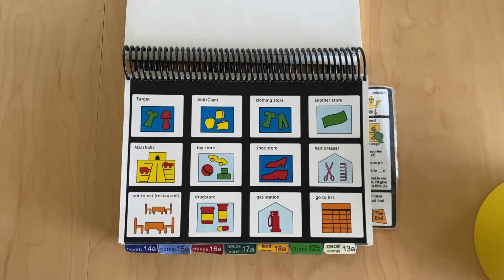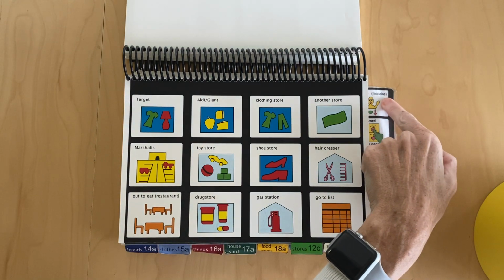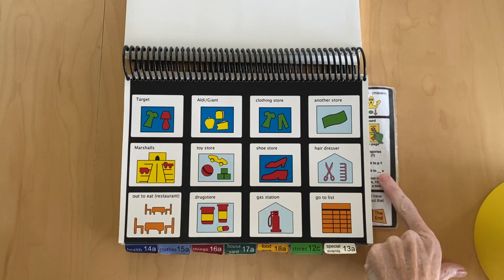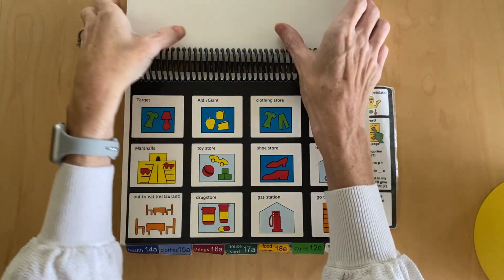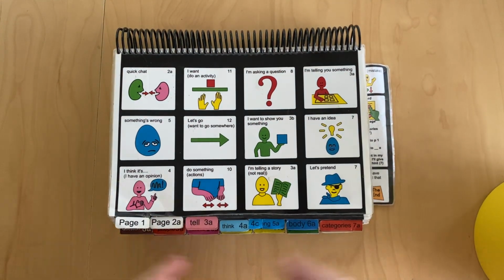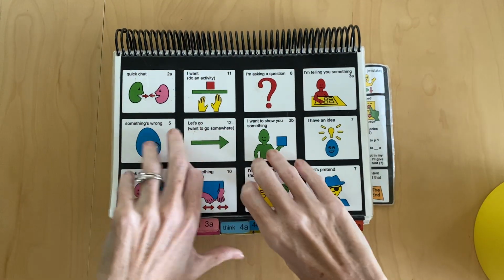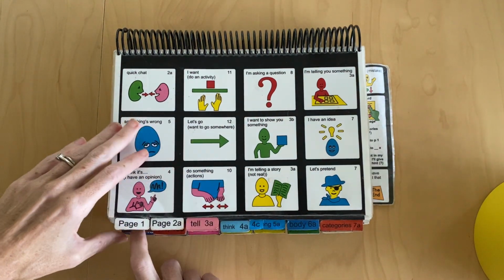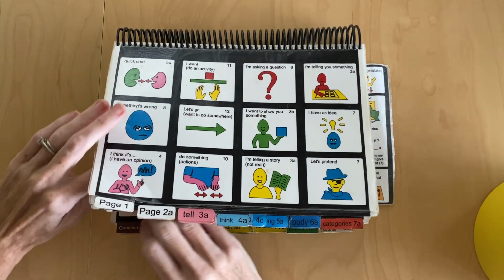She'll say yes. Then I'll say Target, yes. Oops, made a mistake. She says no. Another word, no. Is that all you have to say about that? No. You want to go to Target, and I always try to recap that message. Also, if she's making a long message, I try to recap it along the way. Or if I'm having trouble finding a page. For example, she says, I'm asking a question, and I'm fumbling. I can't find the question. I'll say, Angela, you're asking a question. A question.